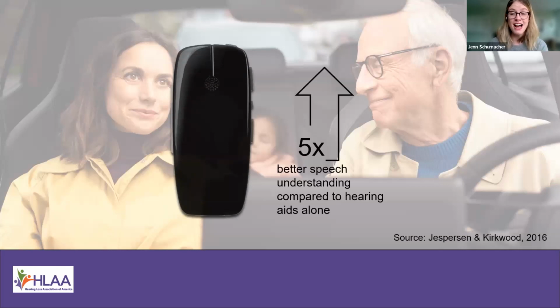When we do that, we see not just a 1.5 times increase in speech understanding, we actually see 5 times better speech understanding. And this is even with older technology. This isn't even a current study that we've done with OMNIA. This is just in general. So for any of you who have hearing aids or are considering hearing aids, please talk to your audiologist about using what we call a spouse mic, a remote mic, this kind of assistive listening device that can help stream someone's voice directly into your hearing aids. It is by far the best way to improve those speech and noise situations.